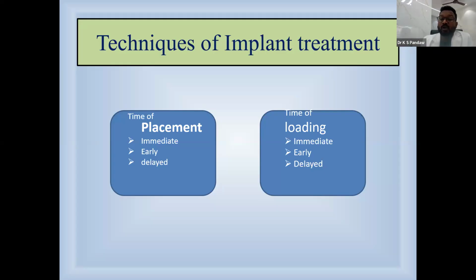If we say that immediate loading implant means immediately after placing the implant, we can load it with the prosthesis, either functional or non-functional. We load the prosthesis; it's called an immediate loading implant. And early loading implant: before complete osseointegration, we put some load on the implants. It's called an early loading implant, or we can use it as a progressive loading implant.